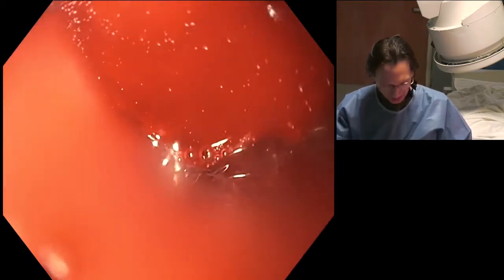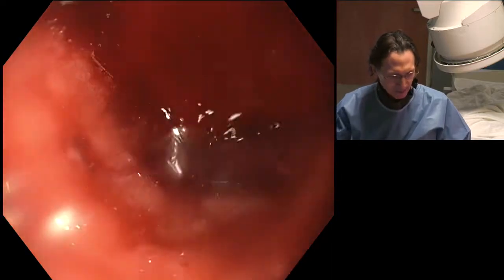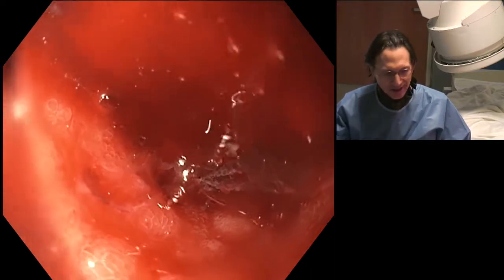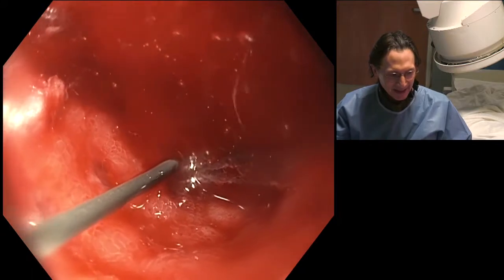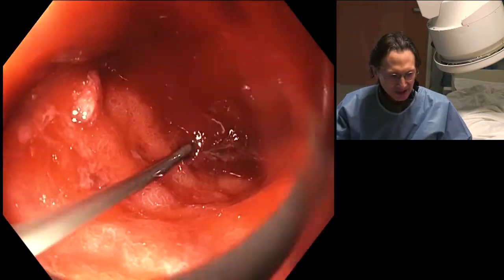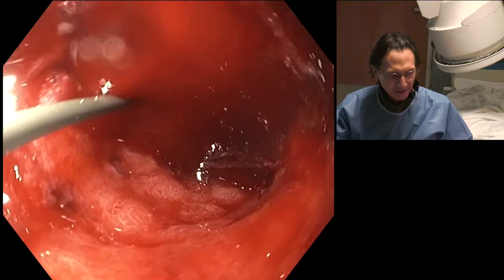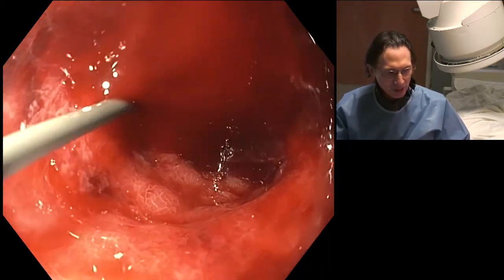Okay, so I'm just advancing the glide wire forward. I'm not putting this through a catheter really because this is just an exercise to prove to you that we're not going to find a lumen. You can never push against resistance. So very gently. You see how the wire just backed up on itself? I'm just advancing very slowly. It's rather blind. Now, I do feel that the wire is going someplace.